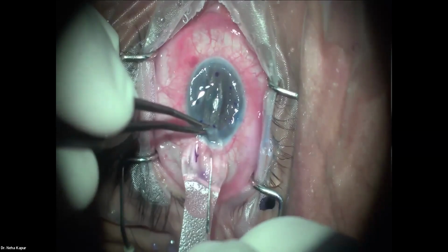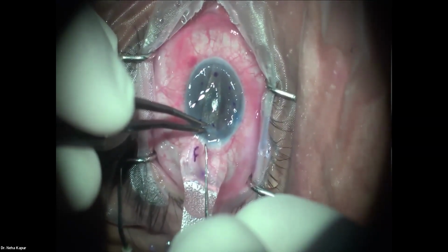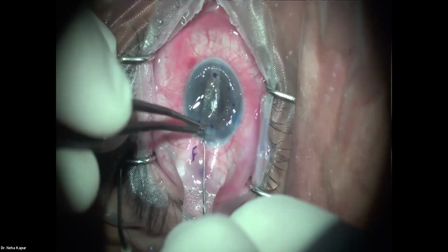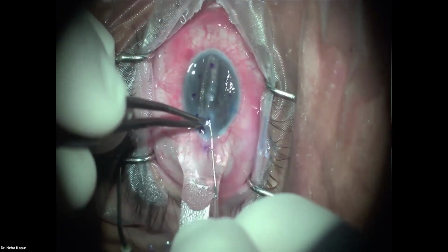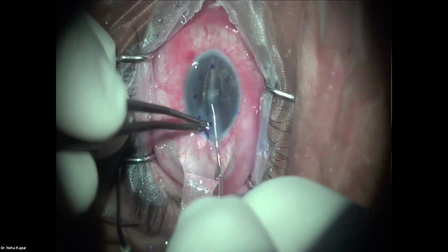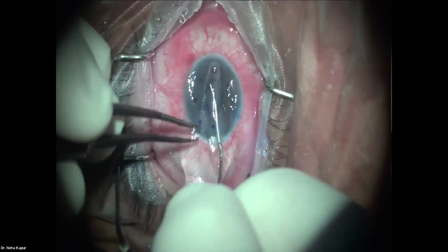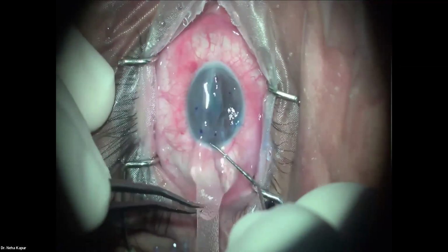Open the mouth of the incision with the limbs. About 1 millimeter into the tissue, you go and engage your dialer and pass it into the eye. Make the dialer horizontal and come out.